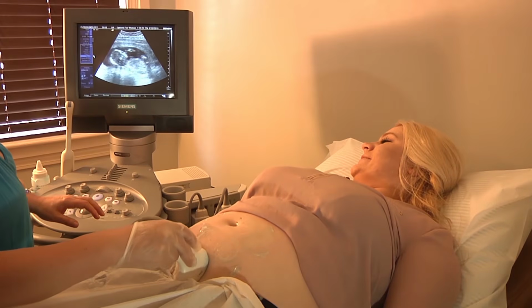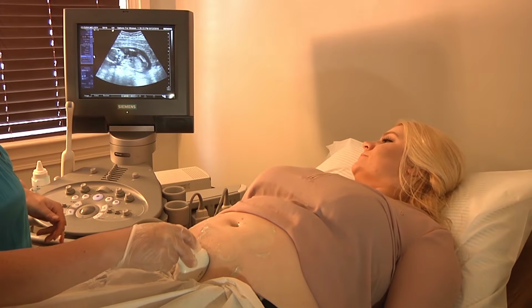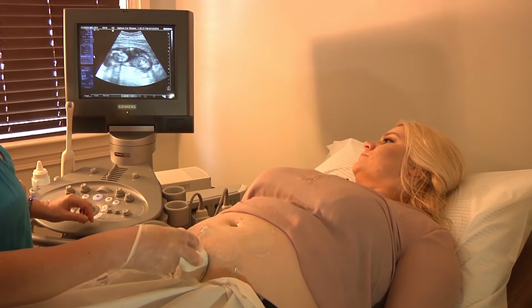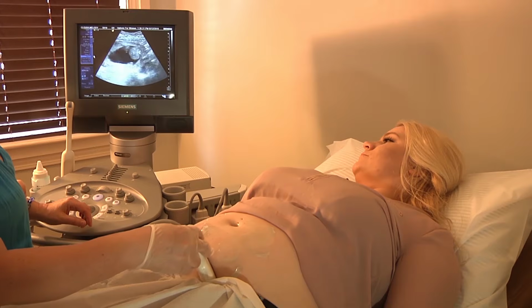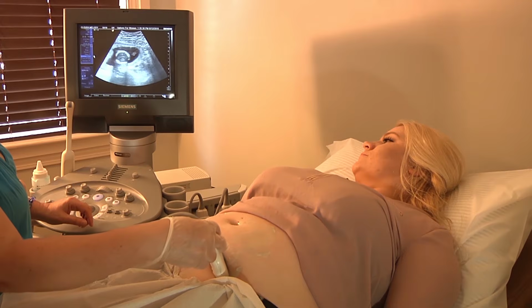Okay, so now I know he's brow up. So that's not a good BPD. But I do see the heart. But you still go transverse to the baby's lie. Okay, now go up to the head. Follow the road. Go up to the head. Okay, now go down to the heart.